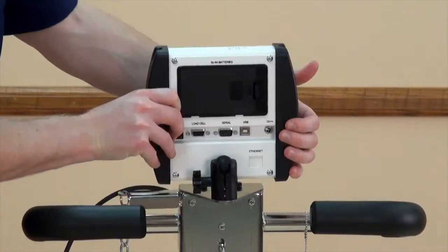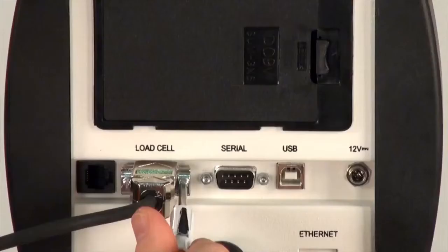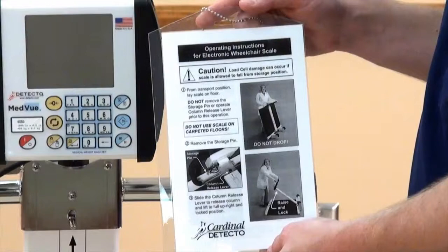This mount is capable of swiveling 350 degrees for maximum visibility. Attach the cable from the column to the connector on the back of the indicator, securing it with the two screws on the connector. The scale's load cells are now connected to the indicator.